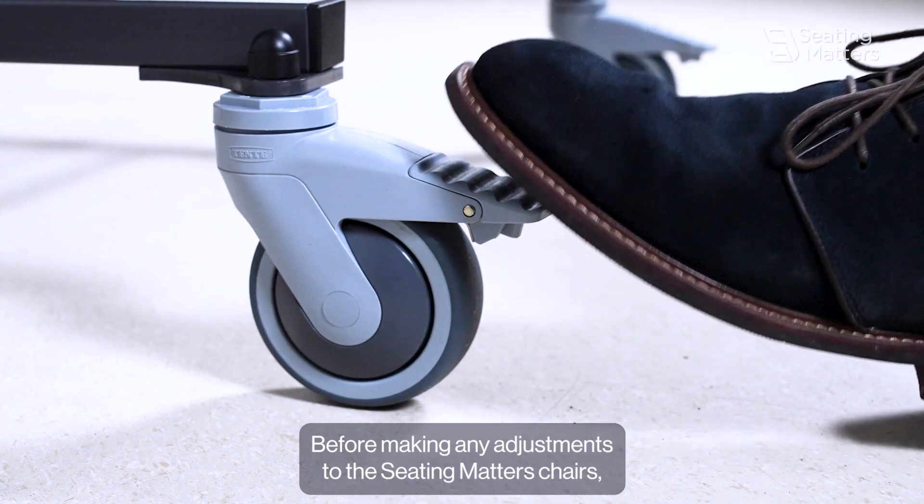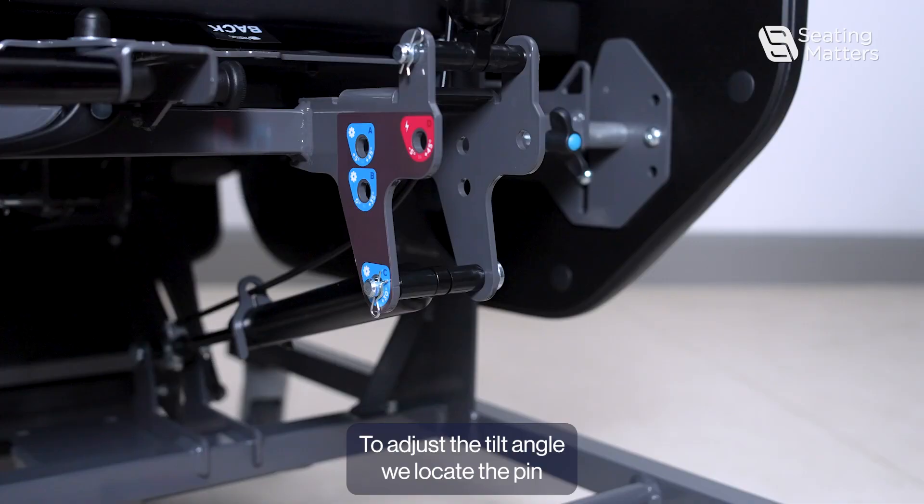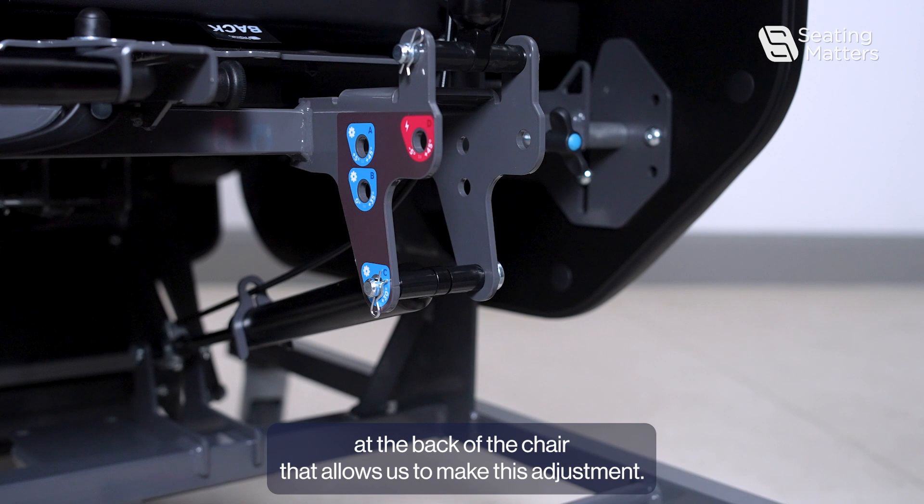Before making any adjustments to the Seatmasters chair, lock the two brake casters at the back of the chair for safety. To adjust the tilt angle, locate the pin at the back of the chair that allows us to make this adjustment.